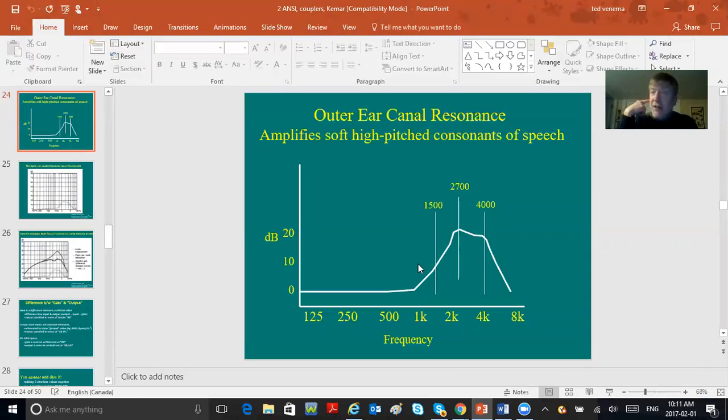Okay, that's the only reason we use this. Otherwise, we don't really care about this anymore. What we do today is we just put the tube in the guy's ear. Oh yeah, by the way, we use this to make sure that the tube is placed properly in the guy's ear. Let me finish on that point before we move on.